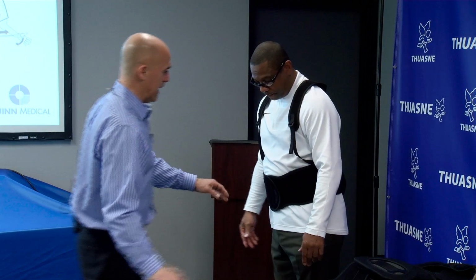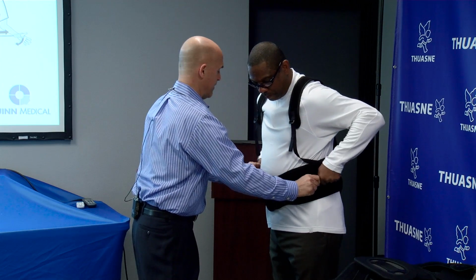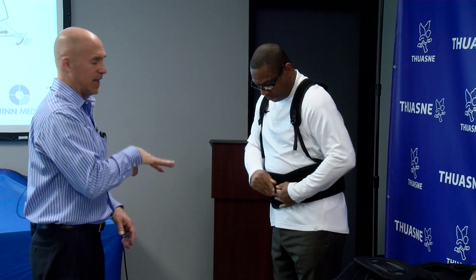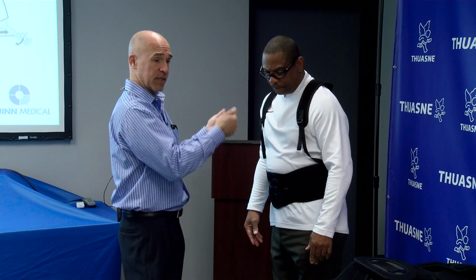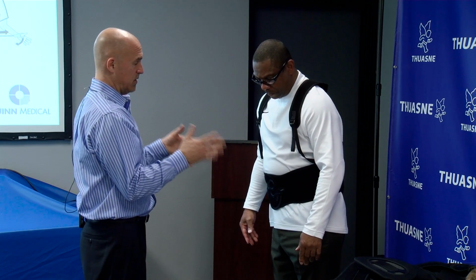So we do that, and then I like Chuck's suggestion to grab the pull tabs. So grab those, and you're going to tighten those. You want to tighten the lumbar section because if you did anything up here, it would potentially pull the brace up. Right? So now our lumbar section is adjusted and tight.